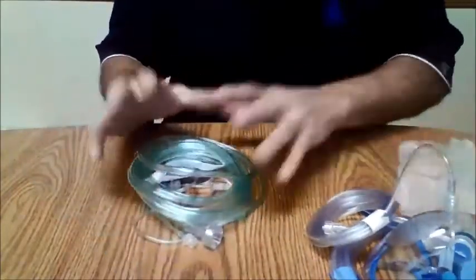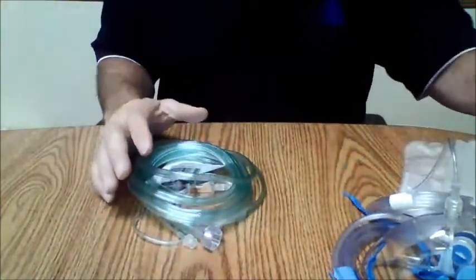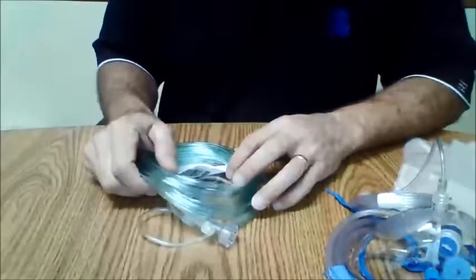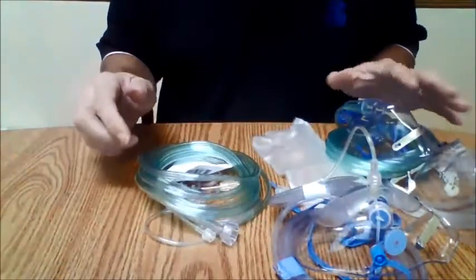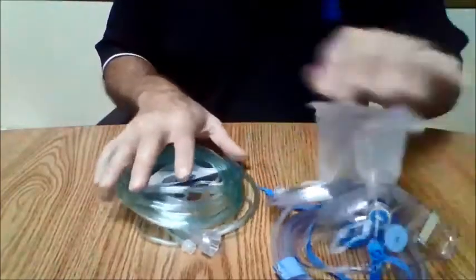So once again, they'll usually start with a nasal cannula, but if they need more oxygenation, they'll then switch to a mask where they can do higher flows. With a nasal cannula, the max is usually about 6 liters of flow, whereas with an oxygen mask, either one of these styles, oxygen rates of 6 liters, 10 liters, and above are very common. So that is a little overview of CO2 monitoring for Bell Medical and for patients.